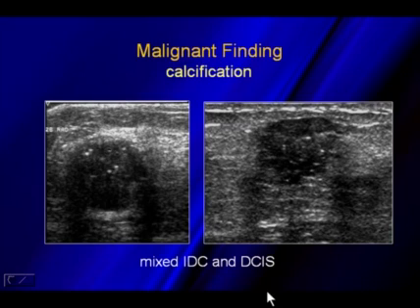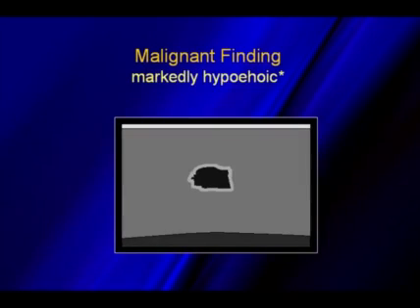Ultrasound is not real good at picking up calcifications, but what your doctor wants to do is see if there is any mass associated with those calcifications. If there's a mass associated with the calcifications, it's going to be much easier to biopsy those with ultrasound guidance than it is stereotactic method. But typically the calcifications seen inside the duct we do not see with ultrasound. The duct is echogenic, the calcifications are echogenic. We typically will only see ones when they are associated with a mass.